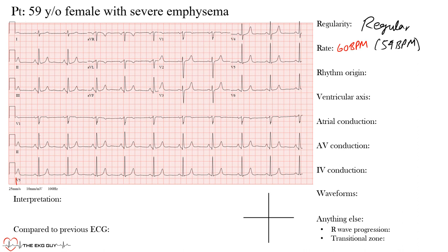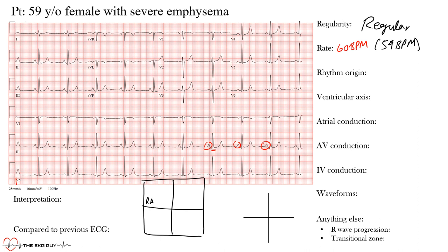Now, rhythm origin: where is this rhythm originating from? We see narrow QRS complexes, so it's likely above the ventricle. We see P waves preceding each QRS complex, so it's probably an atrial rhythm. We need to ask whether it's coming from the sinus node. The sinus node sits up behind the right atrium near the superior vena cava; from there conduction travels through the internodal pathways, AV node, His bundle, bundle branches, fascicles, Purkinje cells, and cardiomyocytes.